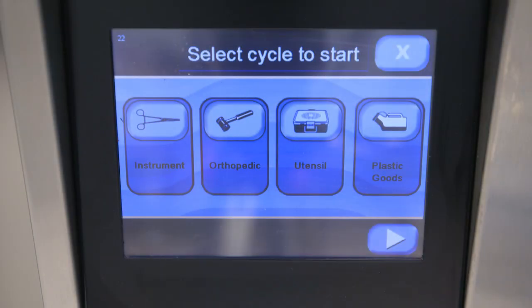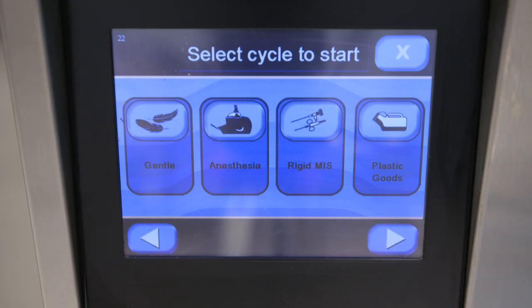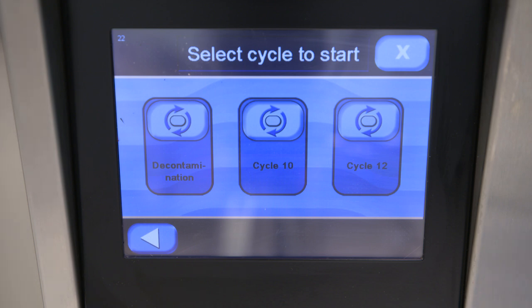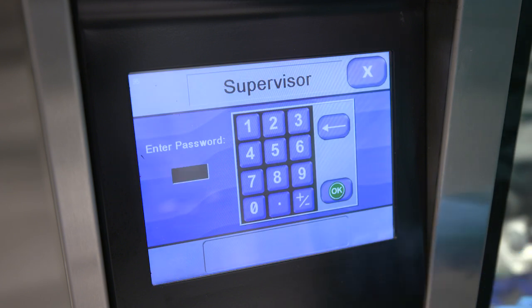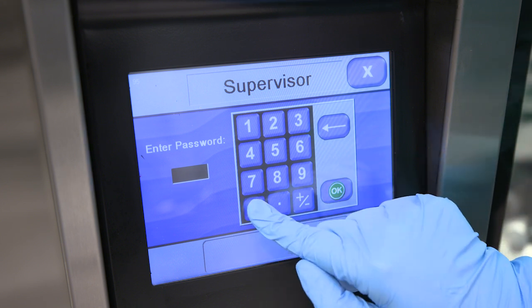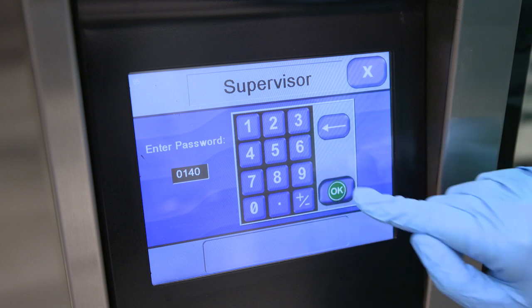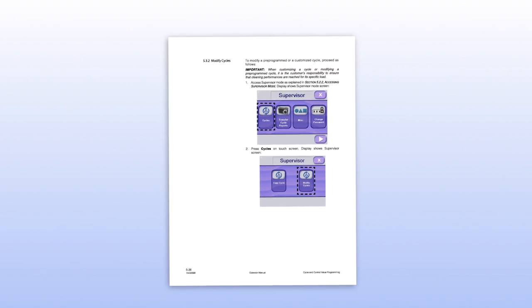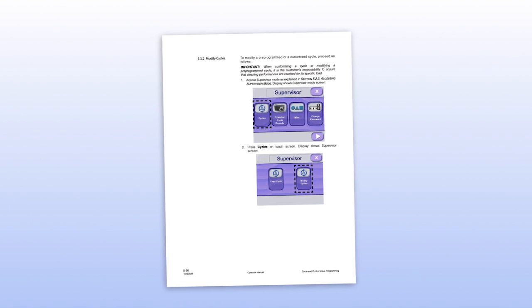Setting cycle parameters or custom cycles: this washer comes with a set of pre-programmed cycles. Each phase within a cycle has its own parameters, which can be modified to better accommodate your department's processing needs. Customized cycles can also be created. Only a supervisor can modify a pre-programmed cycle or add a new one. Start by logging into the supervisor screen, selecting a login name, and entering a password. From here, you can modify a pre-programmed cycle or create a custom cycle.